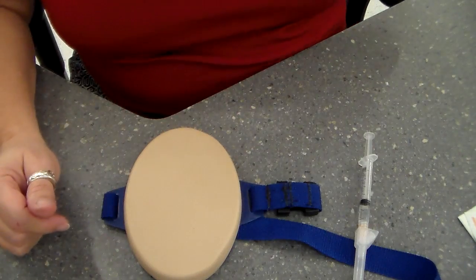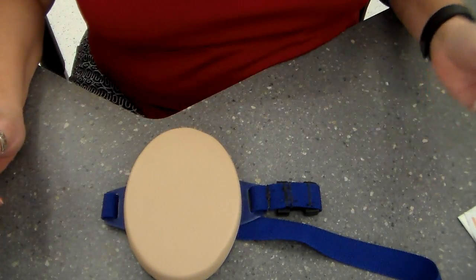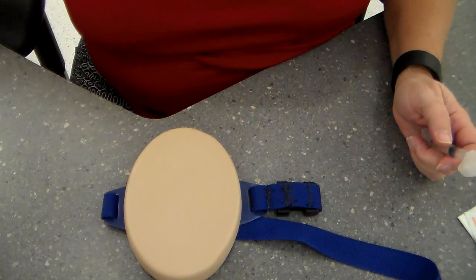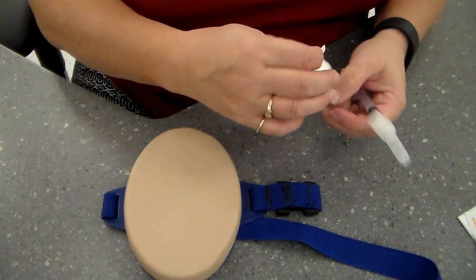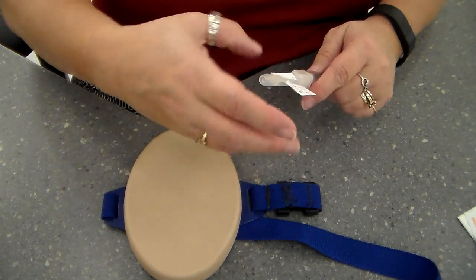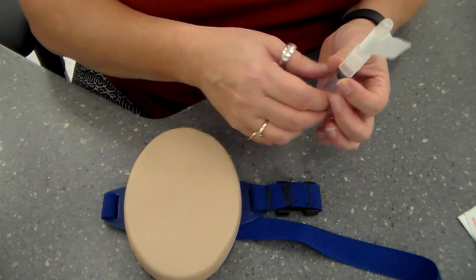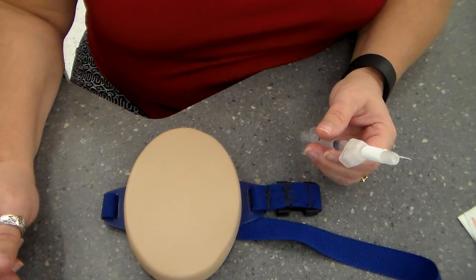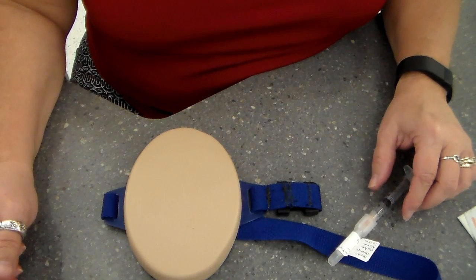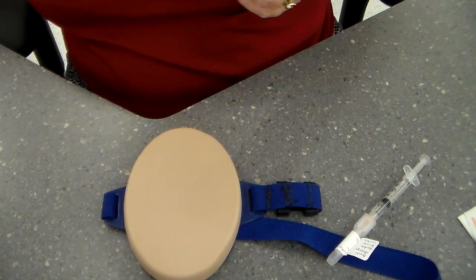So we've gone to our patient's room with our labeled medicine. We have our labeled medicine of the correct dosage, date, time, and all that, right? So we have our correct medication. We've gone to our room, we've done all the wipes of stuff, we have explained it, and we've done hand washing. And now we're going to put on gloves.